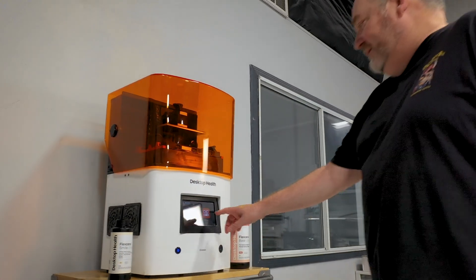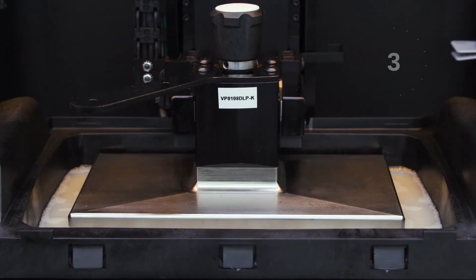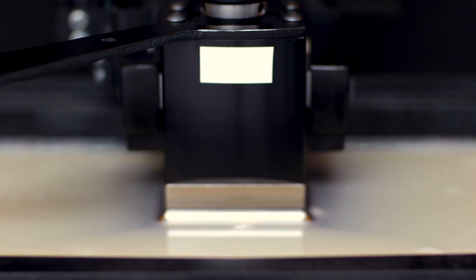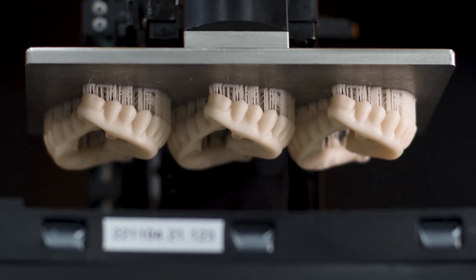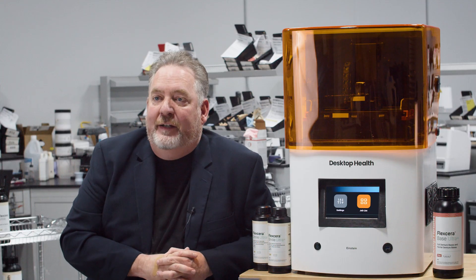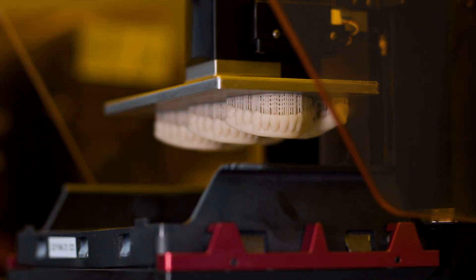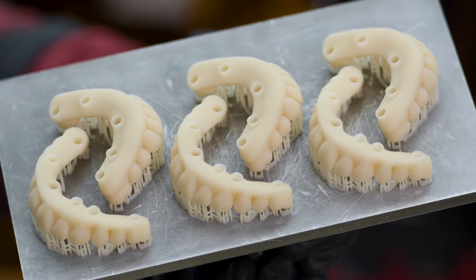When we ran across the Einstein and Flexcera, the first thing we noticed was the speed — it beat all of our other printers. We basically tell our doctors we can get things to them next day. Sometimes we'll get that phone call at three o'clock and they'll say, 'Hey, I got an emergency. Can you do X, Y, and Z?' Well, we use our Einstein for that. We've done up to four to five, six all-on-X's in 20 minutes. It was impressive.